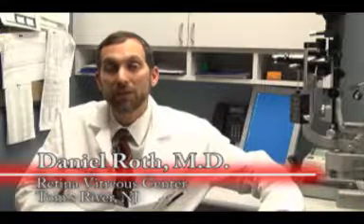The nice thing about the ForeseeHome device is that patients are actively involved in monitoring their vision at home, and there's real data being collected. If there is an abnormality in their pattern of central vision, the device and its software will detect it. It'll transmit that data to a reading center, and often it'll allow the patient to be notified and for our office to be notified so we can see them, check it out, and initiate treatment well before they have significant vision loss at all, and even before they have any symptoms.